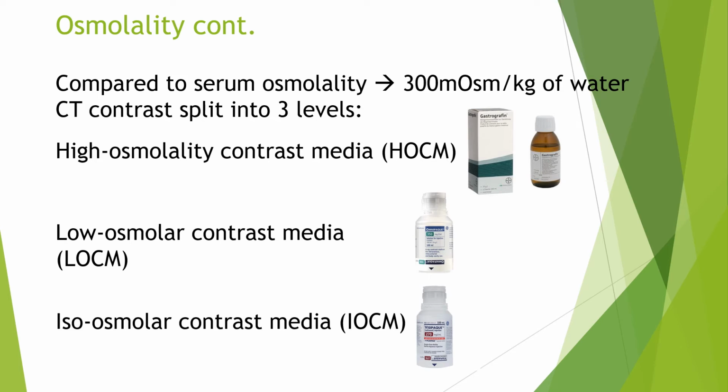The last ones are the isoosmolar contrast medias. They have same or similar osmolality to serum. The only current one that fits this description is Visipaque. This contrast is a non-ionic dimer, meaning there are 6 iodine atoms per 1 molecule. The advantage of this type of contrast is you can use less of it to get a similar enhancement to other contrast medias, but it is usually more expensive and a little bit more viscous.